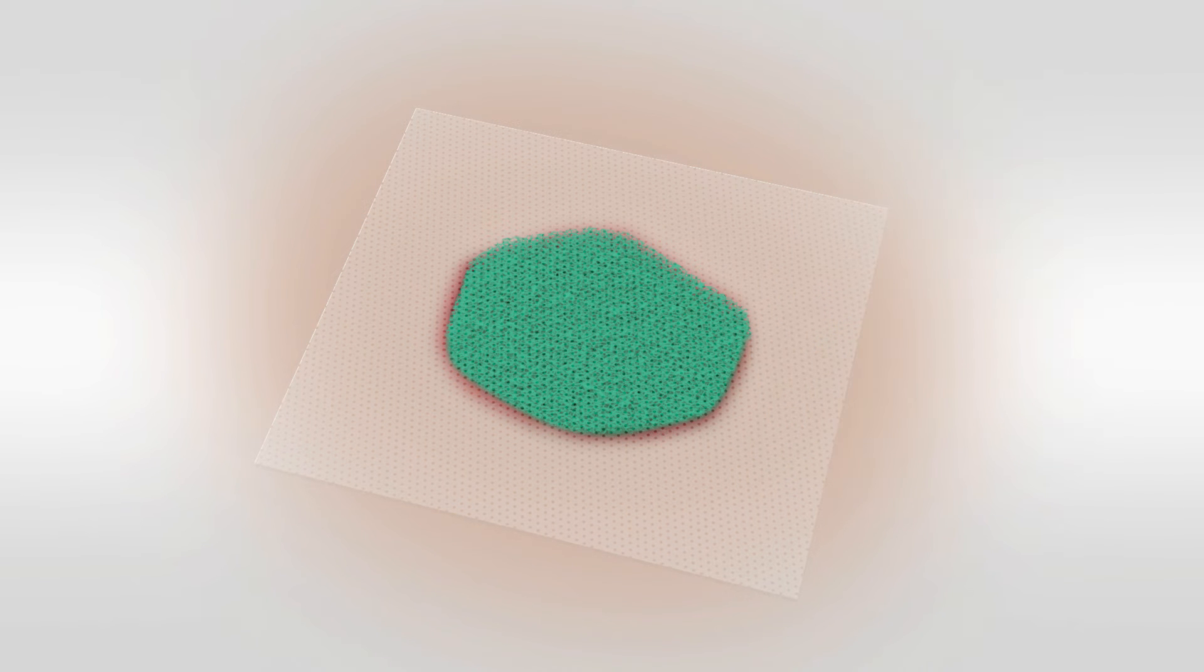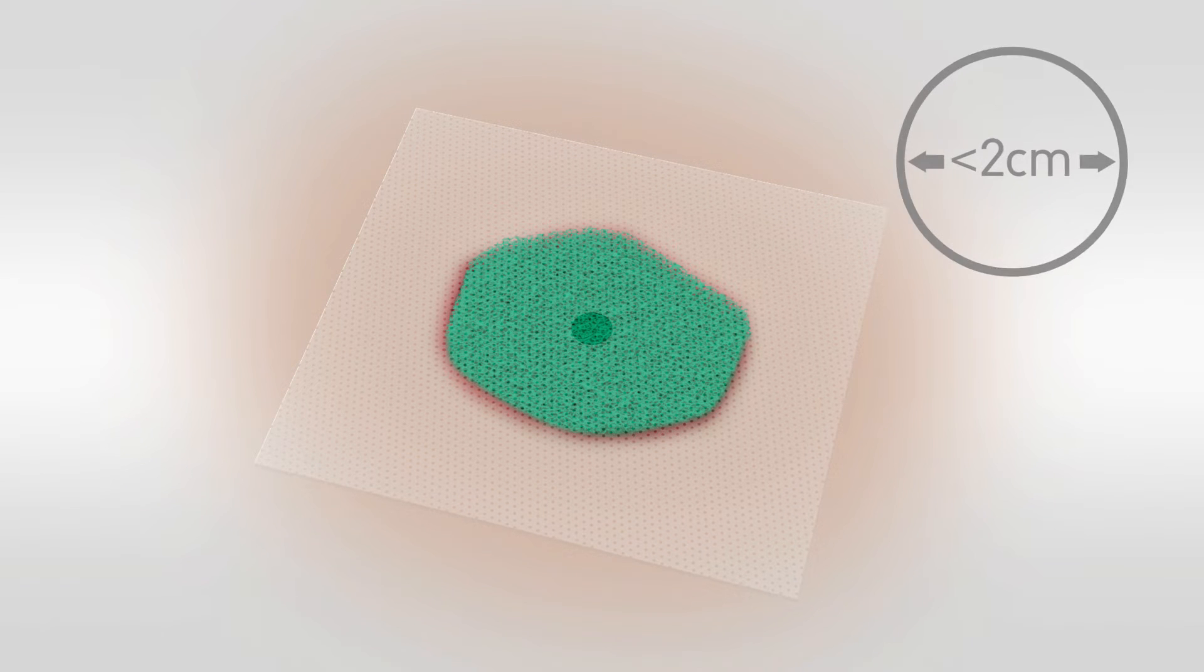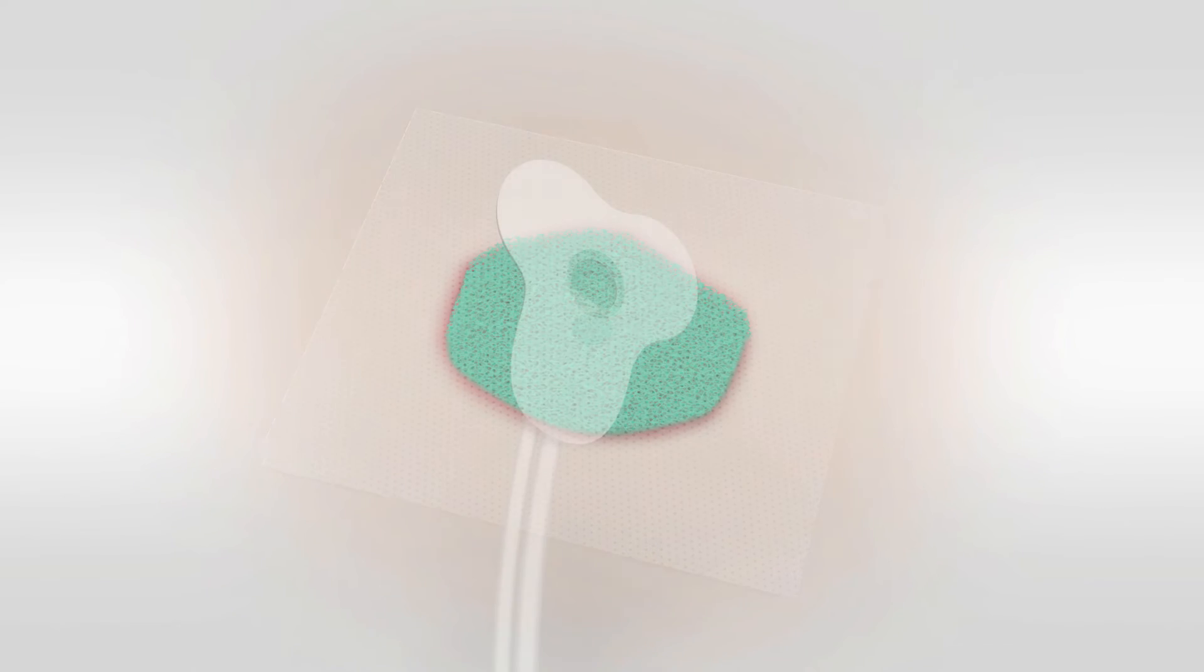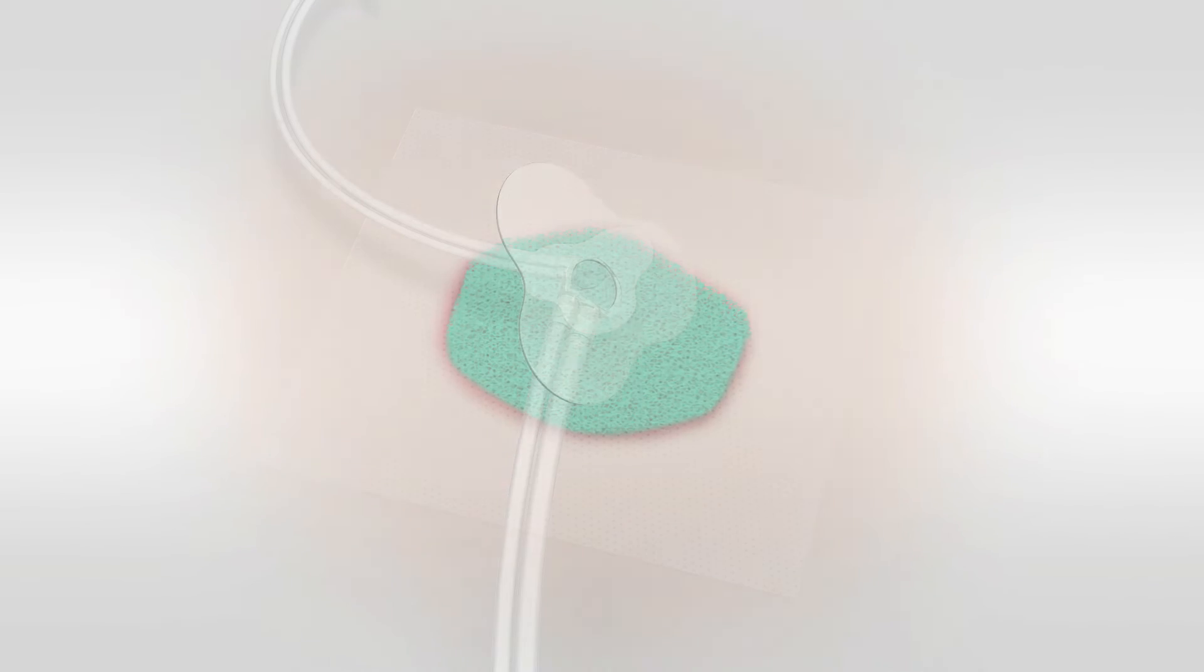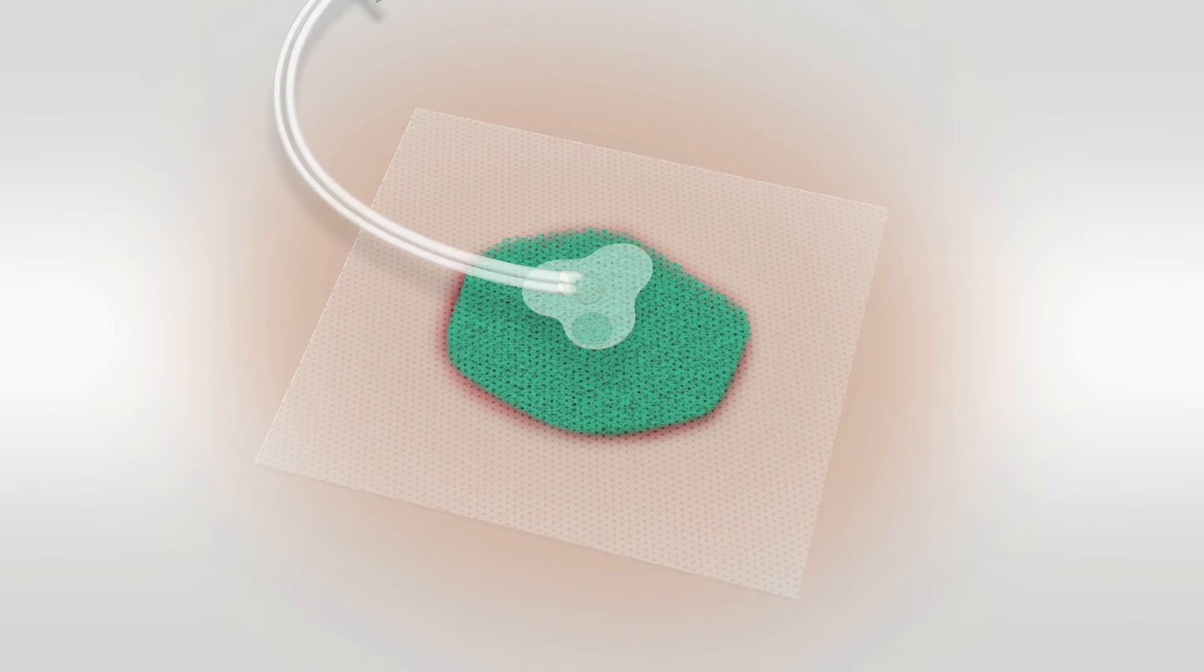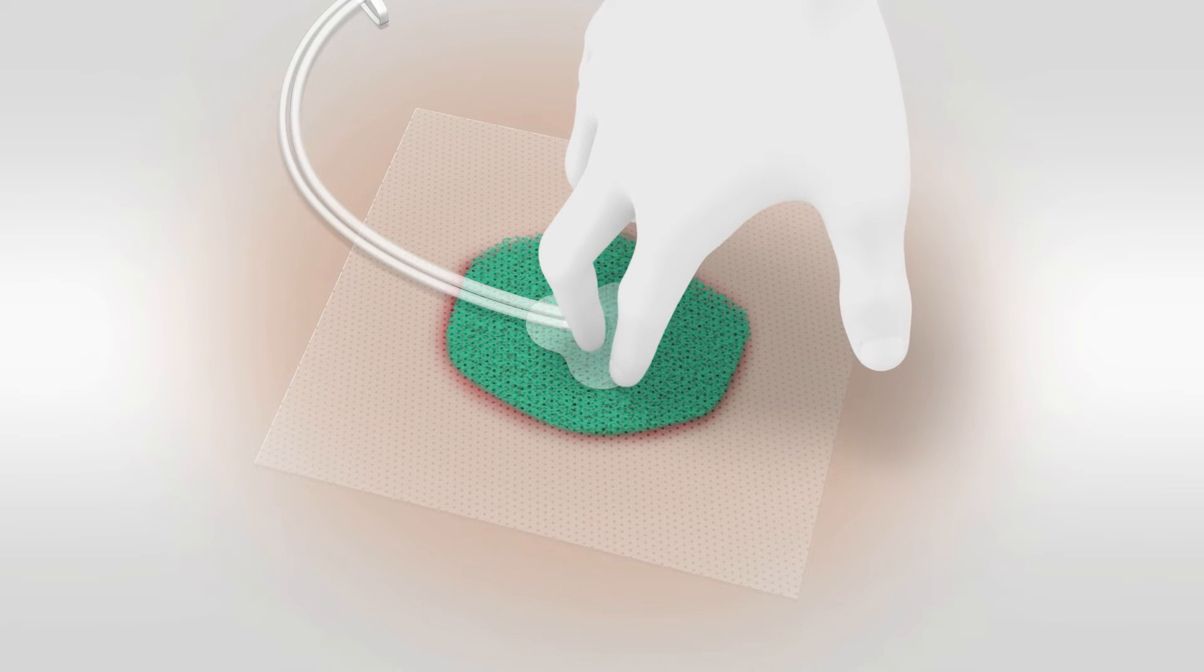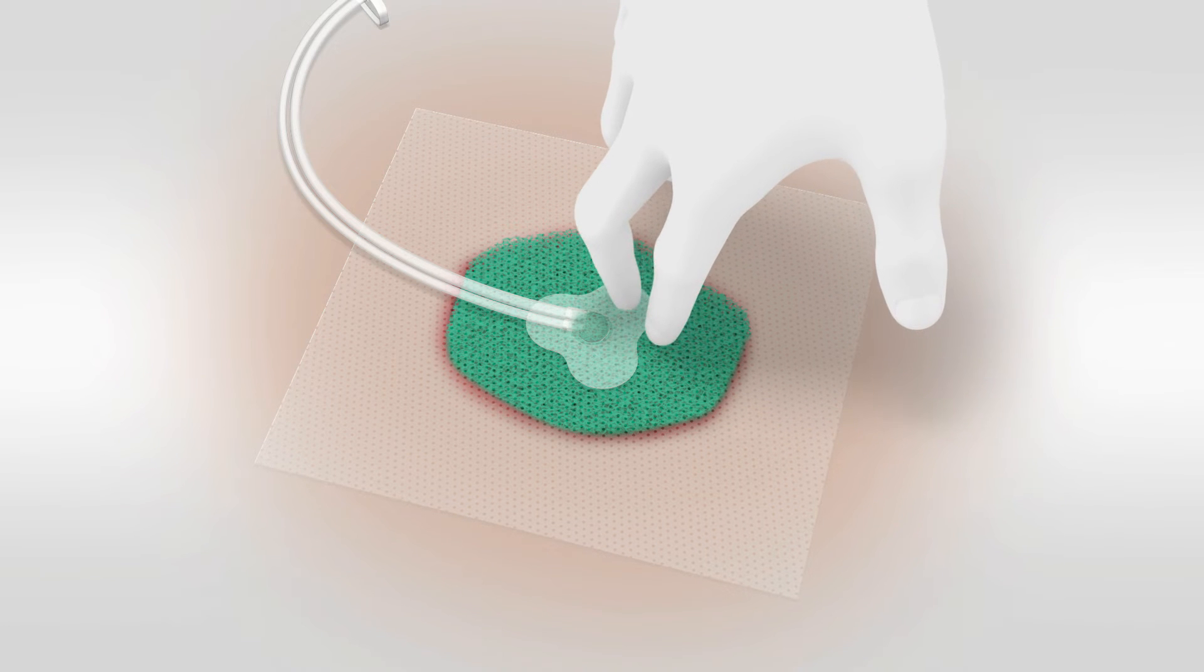Before attaching the transfer port, it is necessary to cut a hole in the film. The hole should be no more than 2.0 cm in diameter. Now, remove the release film on the bottom of the transfer port. Locate the port over the hole in the film and then apply. Smooth around the edges of the transfer port to ensure you have a good seal.